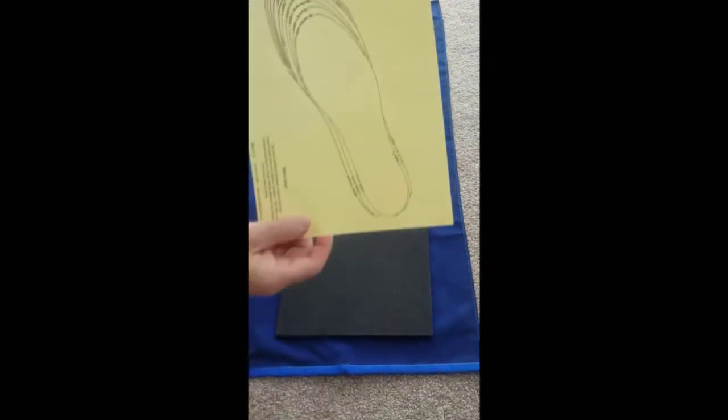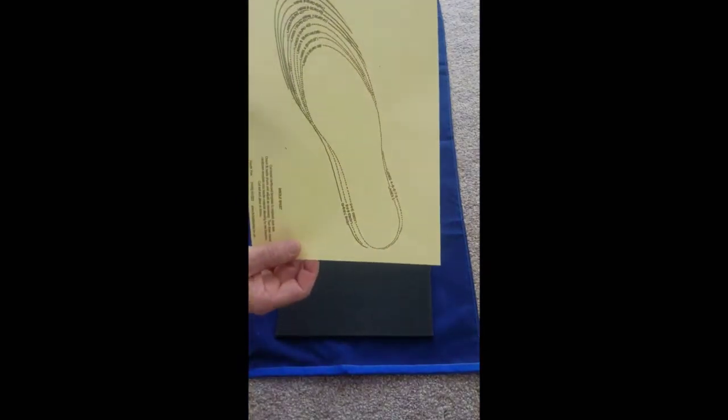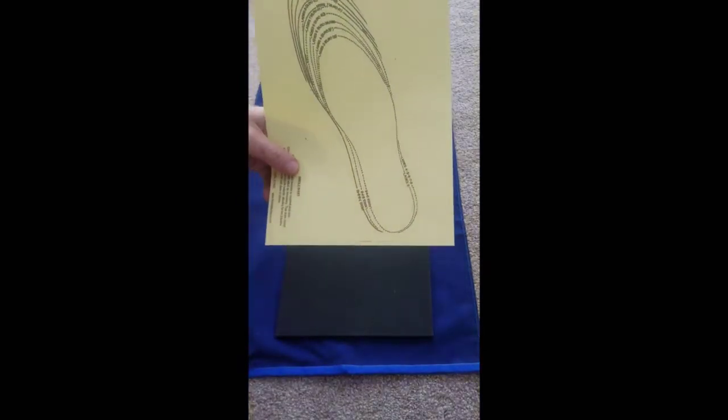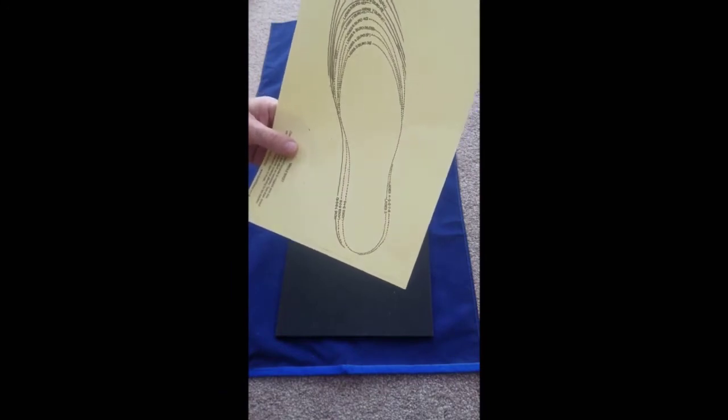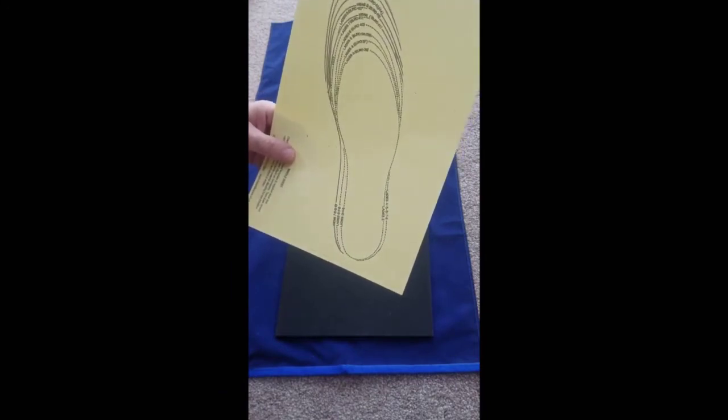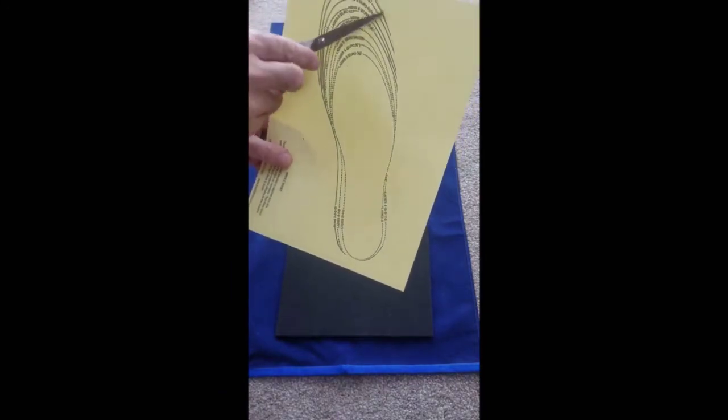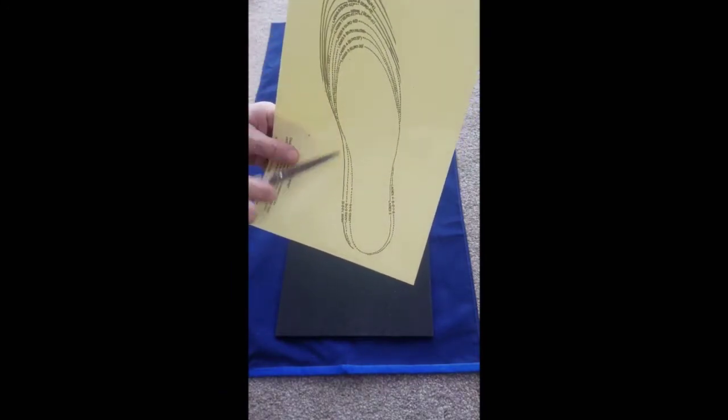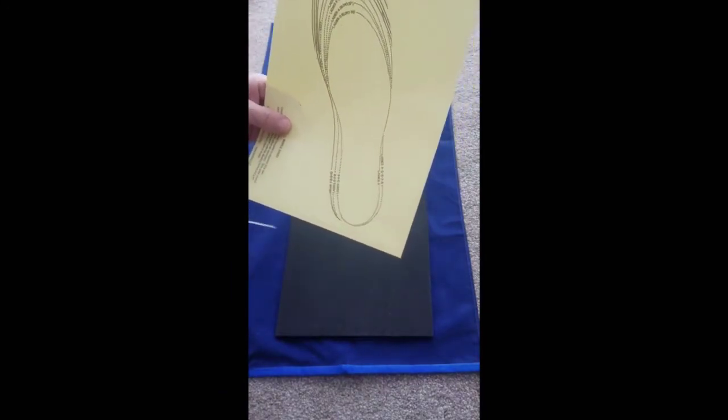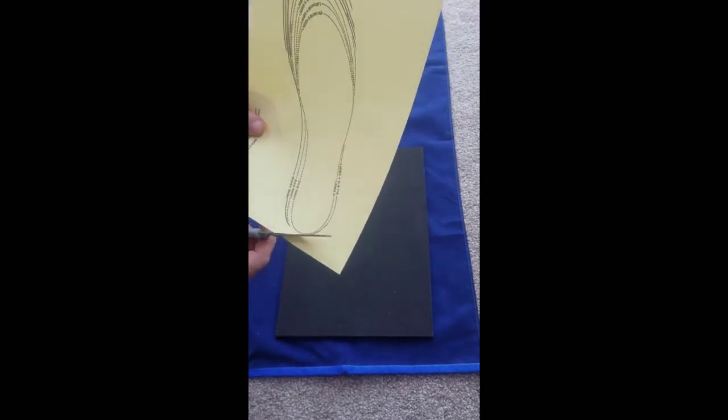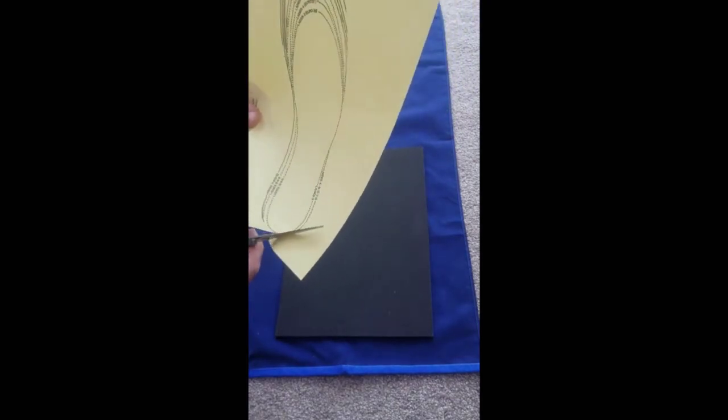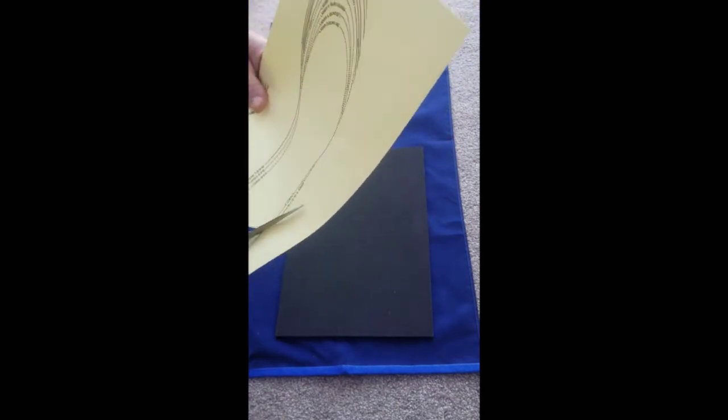It's supplied with a template and the way that we do this is to cut out the size that's required according to what's written on the template. So if we went for a men's size 10, I would cut it like this.